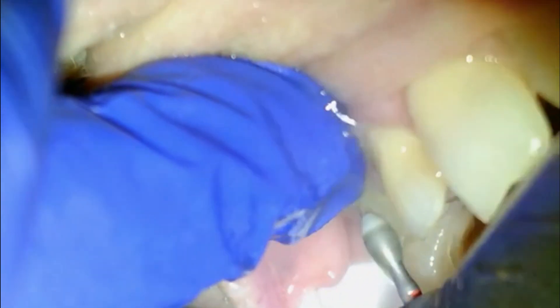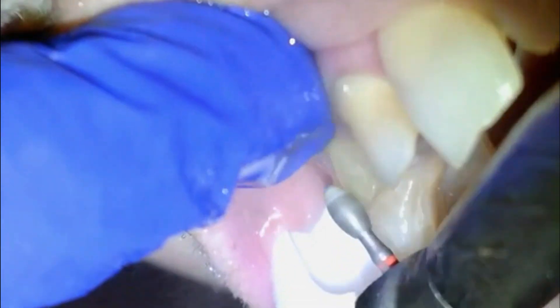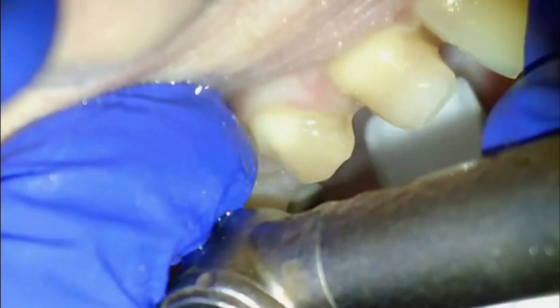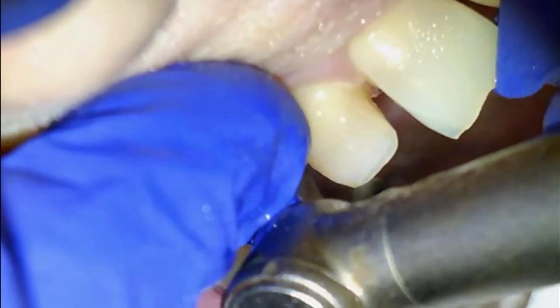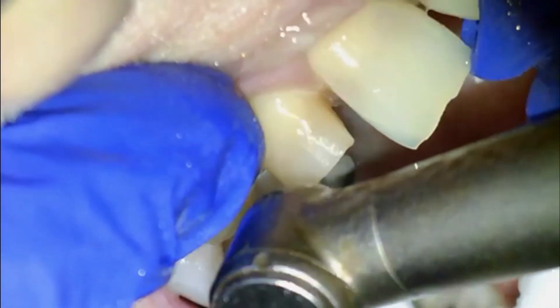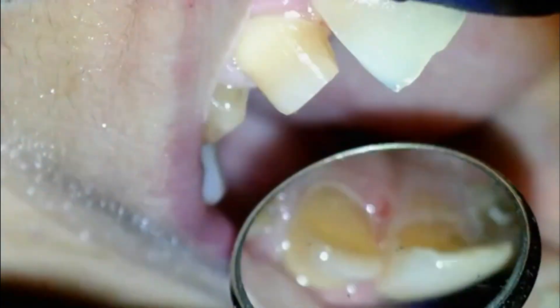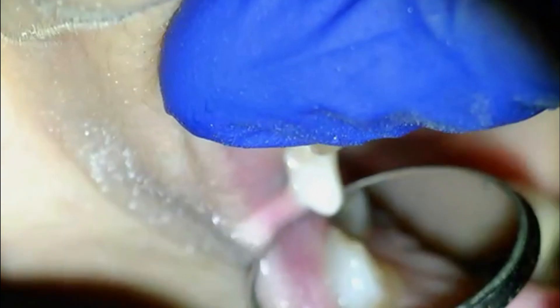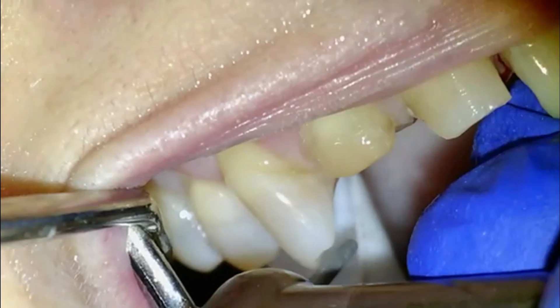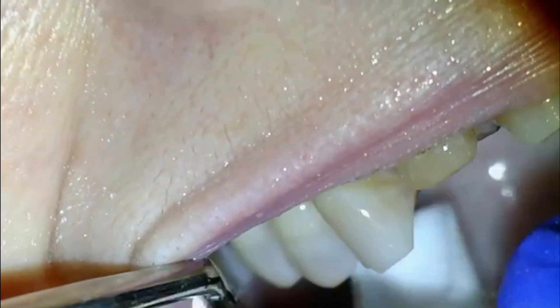I always do the front two teeth first and leave the canines because the canines are a good stopping point — the patient isn't biting funny and always has a good occlusal stop, so I can make the other teeth fit to where the patient naturally bites. I always prep the canine last. In this case, the canines were spared a little bit on the wear and attrition that the front four incisors got. Here we are at the canine — you can see she does have some abfraction happening at the cervical aspect of that.